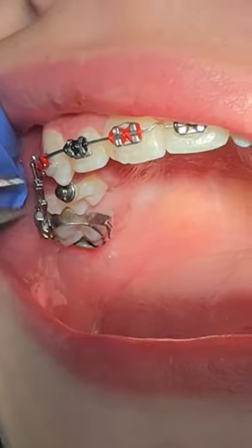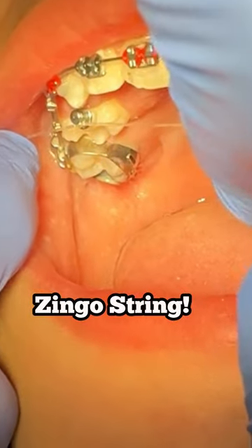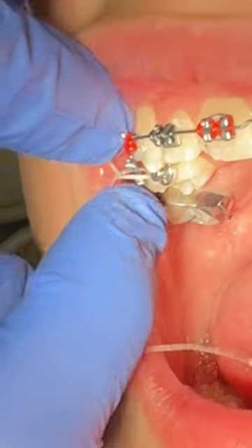We just needed to get a force on it, so we bonded a button on this tooth and used what we call a zingo string — it's just a little elastic to get a force on the tooth. Here we are tying in the zingo string and we attach that to the wire.